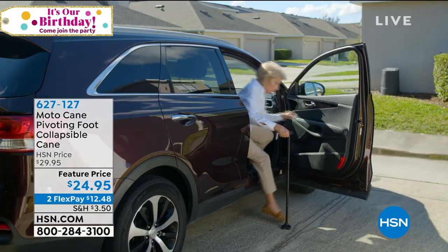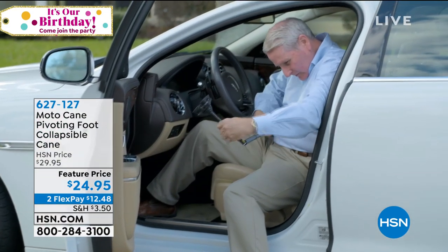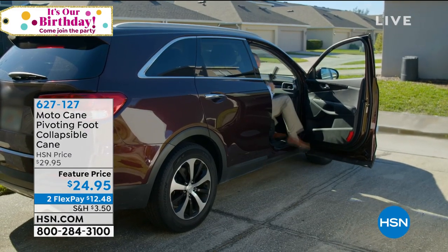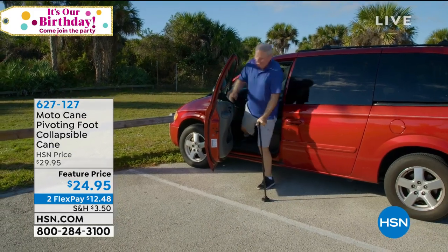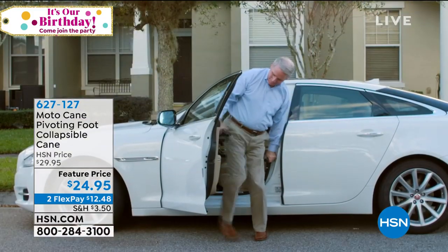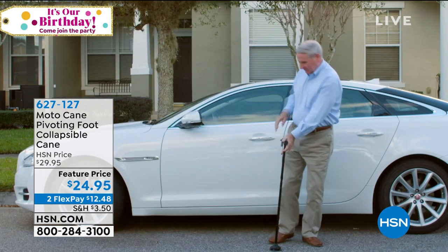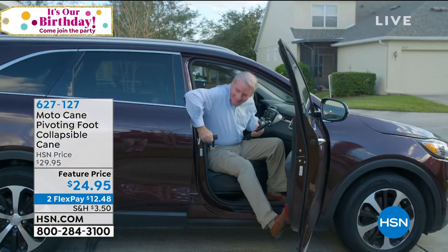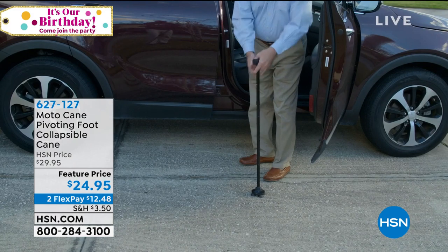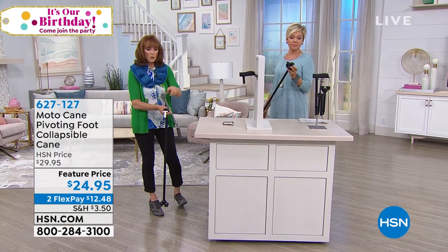There's nothing more valuable if you've got a family member getting up there in age with some mobility issues and just a little unsteady on their feet — or maybe you just got done with surgery and you're getting back to normal. It's item 627-127 and it's been a huge seller. Grandma and grandpa can't be left behind because a regular cane has only one point of contact and you just don't feel stable.